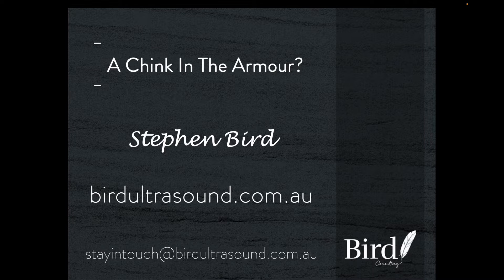Welcome to Bird Ultrasound Case of the Week. The title this week is A Chink in the Armour. When I perform a musculoskeletal examination, you might think that I'm rather infatuated by the tendons, the ligaments, all the soft tissue structures — and that's fair enough. But there's another component that I'm really interested in, and that is the bone surfaces.